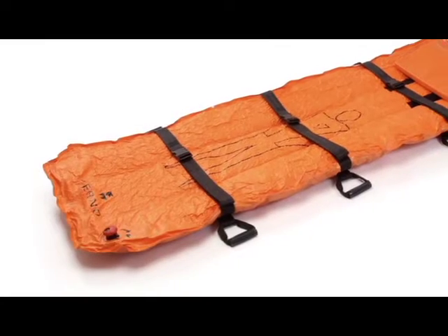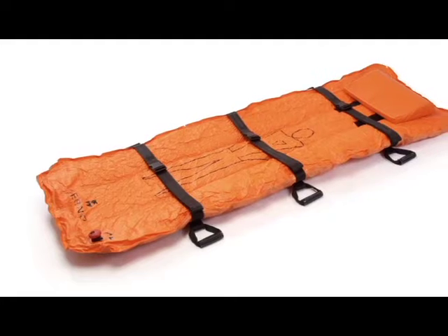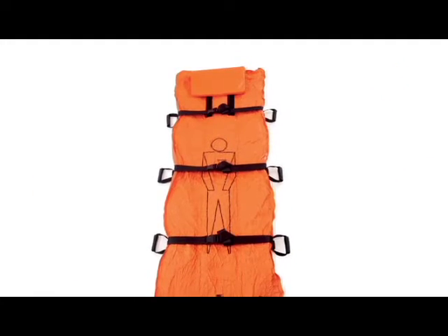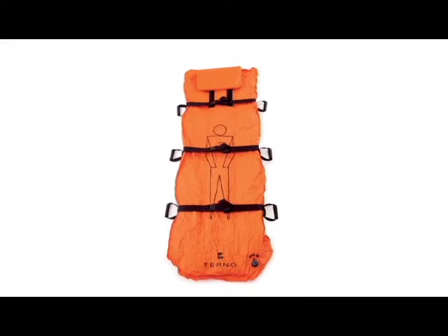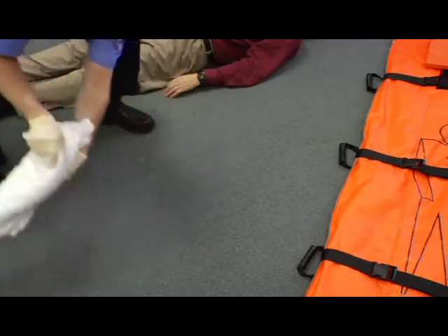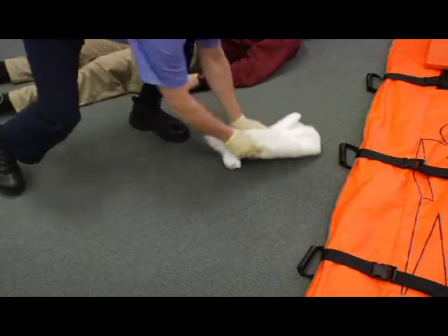The FERNO vacuum mattress is a vacuum activated full body splint device designed to immobilize all or part of a patient's body. It features six carrying handles, three patient restraints, and a pillow with adjustable positioning. Sharp objects can damage the mattress. Clear sharp objects away or cover them with a thick blanket before laying the mattress down.